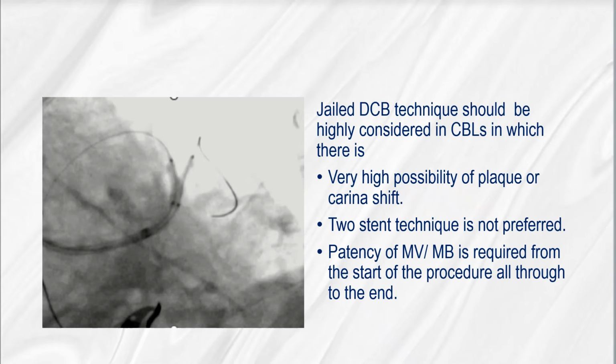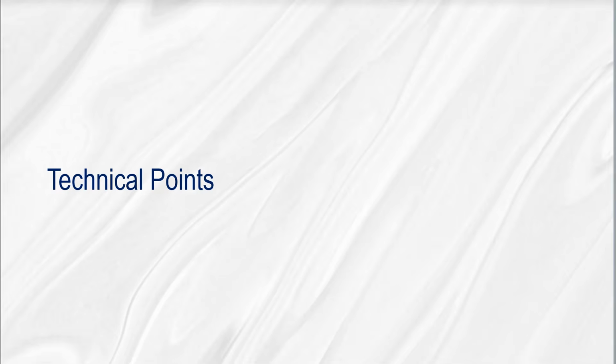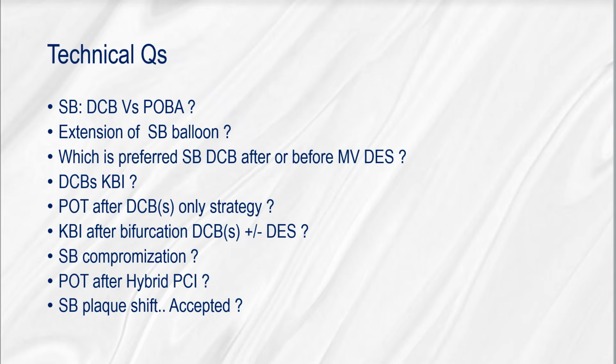Simultaneous jailed drug-coated balloon technique should be highly considered in cases of bifurcation lesions in which there is very high possibility of plaque or carina shift. Two-stent technique is not preferred, and patency of the main vessel, main branch, is required from the start of the procedure all through to the end. Cases of this recent technique will be discussed in a later video. Regarding technical points, these are the frequent questions and their answers.